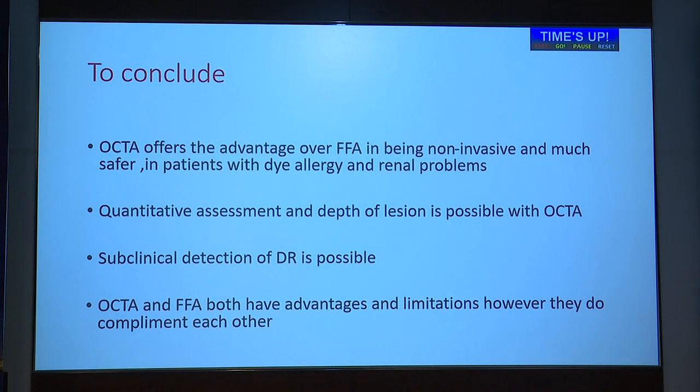I will just conclude by saying that OCTA does offer the advantage over FFA in being a non-invasive test, and much safer in patients with dye allergy and renal problems where an FFA may probably be contraindicated. It also helps us in a quantitative assessment and depth of the lesion. You can really make it out on an OCTA, which is not possible on an FFA. A subclinical detection of changes of DR again are very well made out on an OCTA, which again you will miss on a fundus fluorescein angiography.